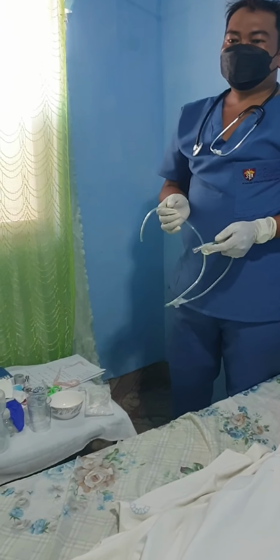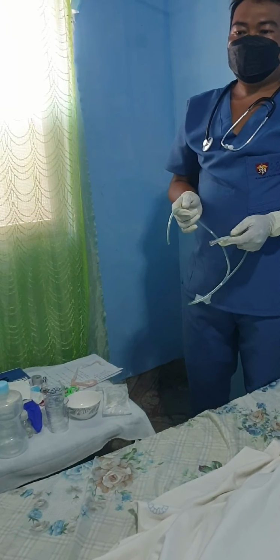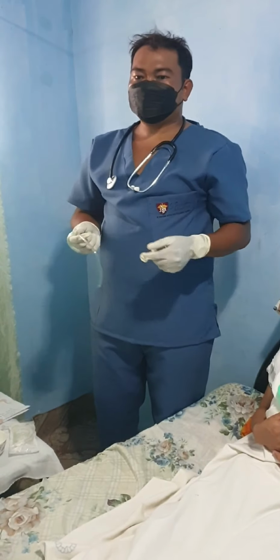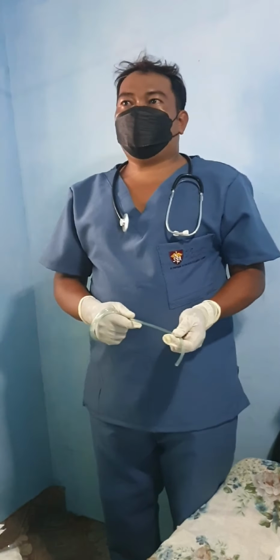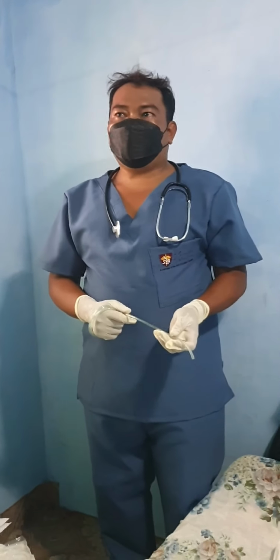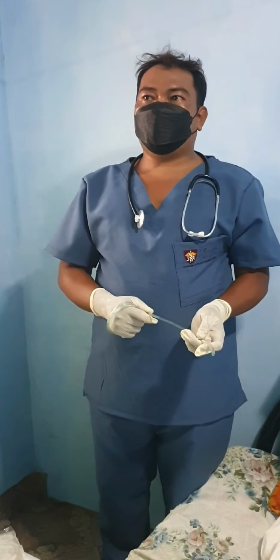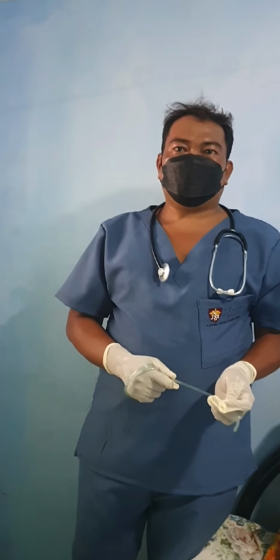Coil 10 to 15 centimeters of the end of the NGT around your gloved finger and then release it. Curving the NGT around your finger helps it to conform to the normal curve of the nasopharynx. Have the patient drop the head forward and breathe through the mouth. Dropping the head forward closes the trachea and opens the esophagus, which allows the NGT to pass more easily through the nasopharynx and into the stomach.